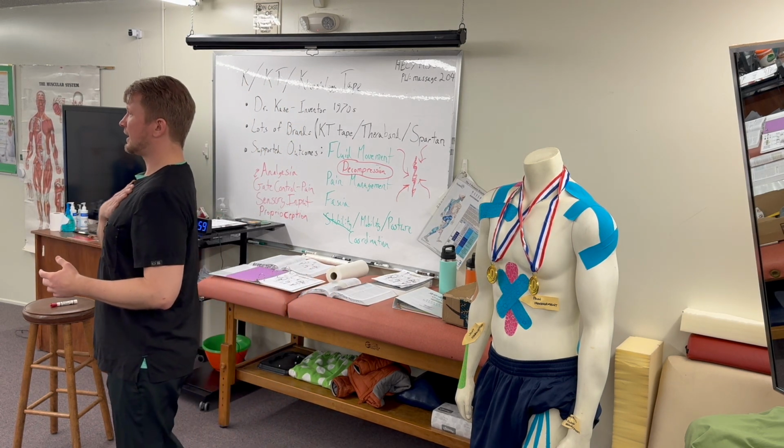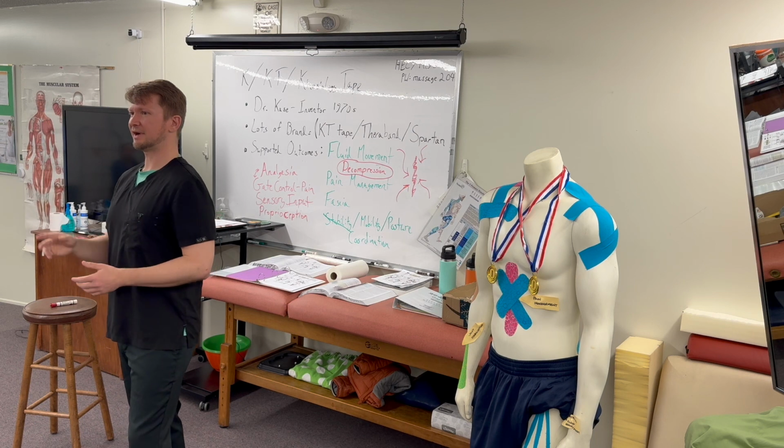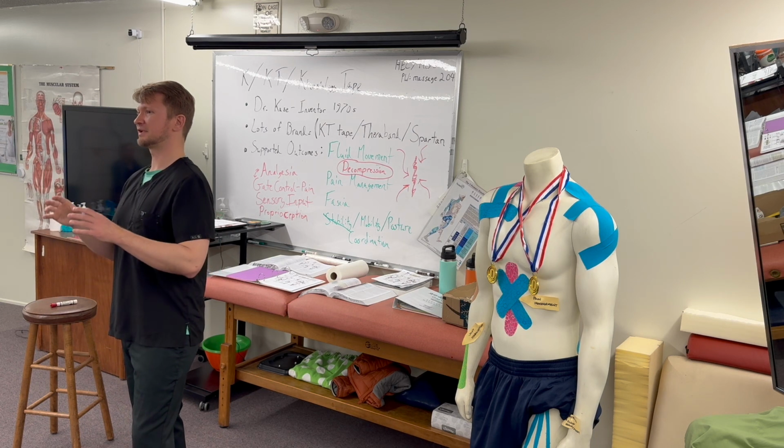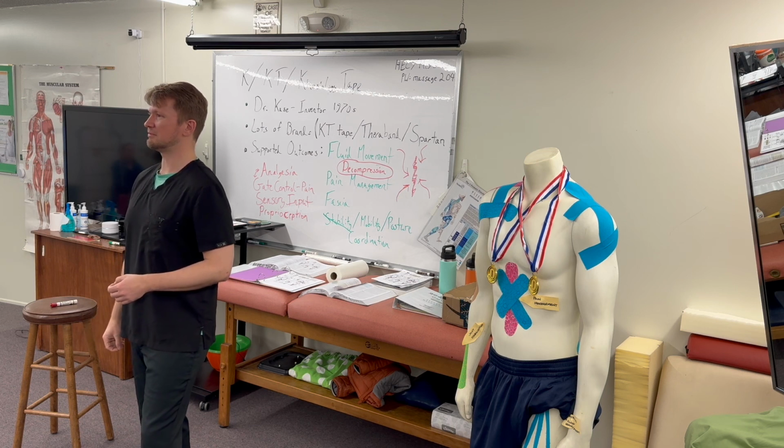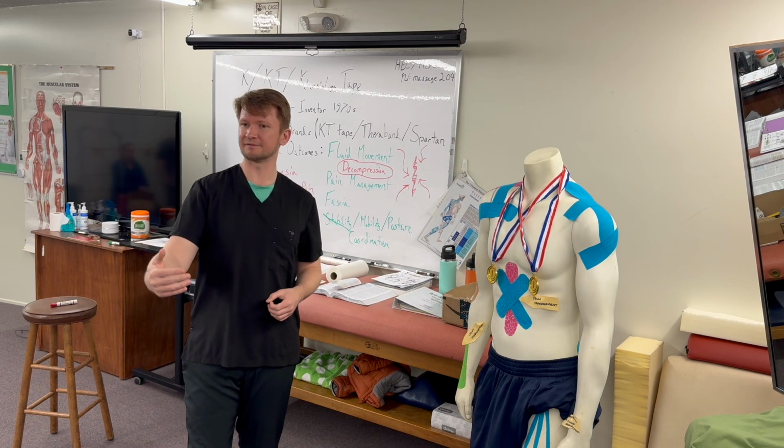So we do our massage part, and then we put a piece of tape on it. Now we have the tape there to help keep the effect of the massage going for a few more days. So you may be able to extend the benefits of any therapy.